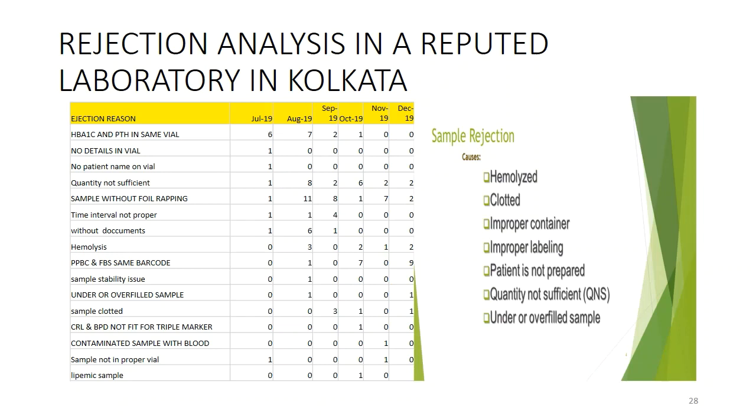To maintain quality, it is important for a laboratory to document every cause of rejection and to maintain a log sheet, because any improper sample may lead to erroneous results. But at the same time, if there is excessive rejection, it is also the responsibility of the laboratory to call and sensitize the client and arrange for proper training for the phlebotomist or whoever is responsible, so that rejection can be avoided. Because sample rejection is also a traumatic experience for a patient or customer who needs to again give his or her blood, right? So excessive rejection is also a bad quality parameter for a laboratory.